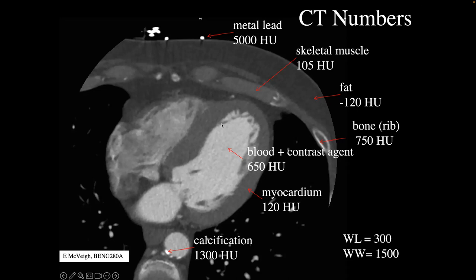There's also a subtlety to that, and we'll look at this. If I had an X-ray beam that came from this direction and went all the way through all of this iodinated blood, by the time it got to this tissue here, the X-ray beam has changed its character quite a bit. A lot of the lower energy X-rays are gone. So you get differential absorption of low energy X-rays versus high as you're going through this. And so the X-ray beam that hits this tissue for that angle is different than the X-ray beam that hits this tissue from the opposite direction, because you haven't had time to absorb all of those low energy X-rays. So that's called beam hardening. It's an artifact.